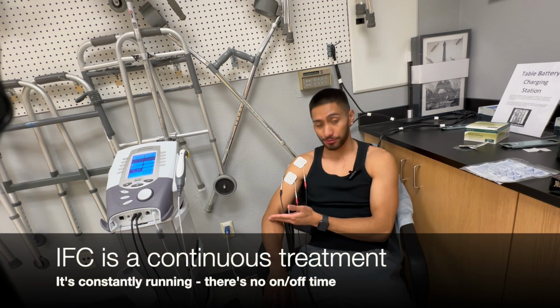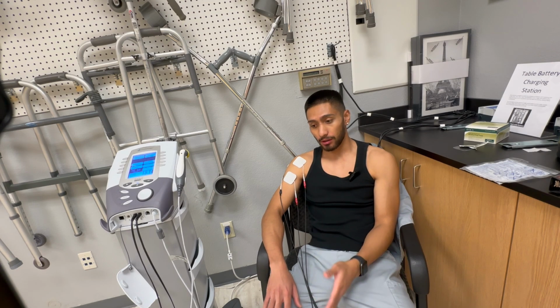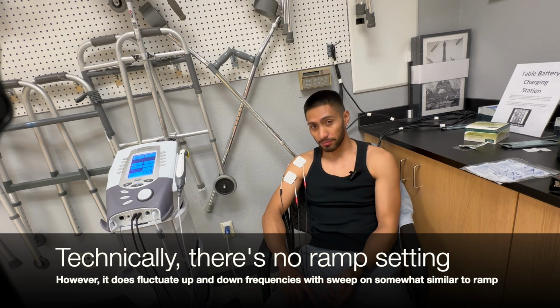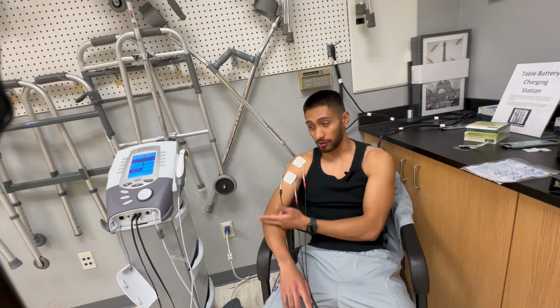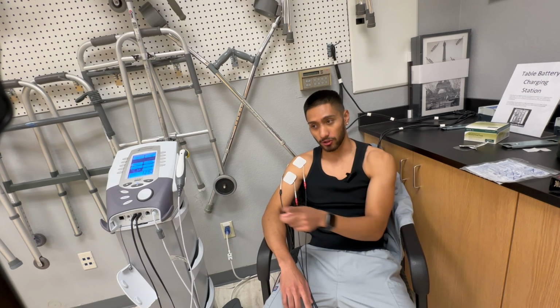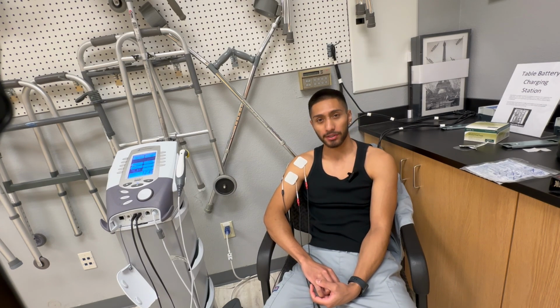This is a form of continuous treatment because it's constantly running between that 2 hertz to 10 hertz frequency. There's no on-off time. There's no ramp setting. Technically there is no ramp setting, but because of the 2 hertz and 10 hertz frequency adjusting, it's slightly on its own ramp, but technically not a ramp setting like specific devices, like the TENS units or NES units that we have.